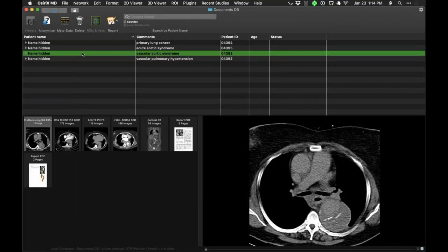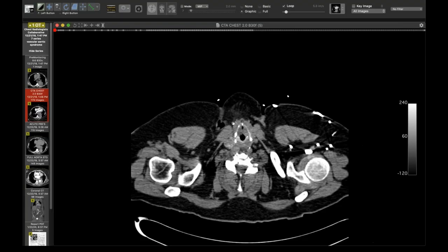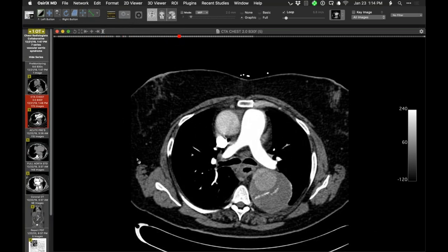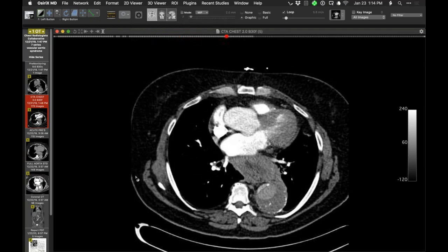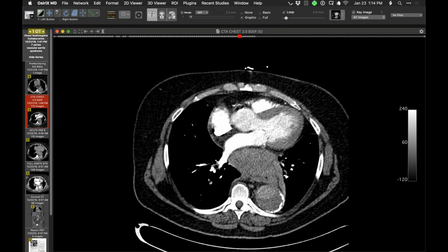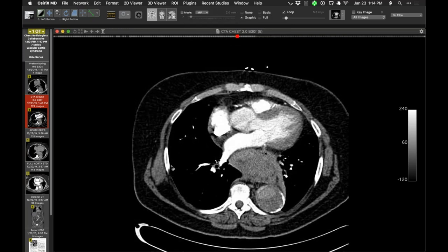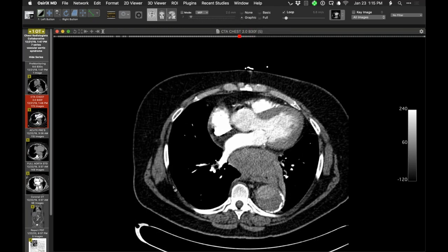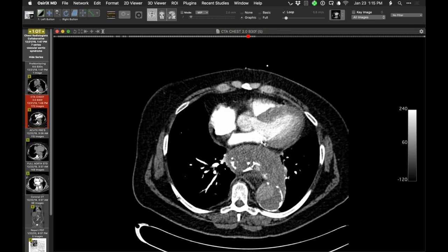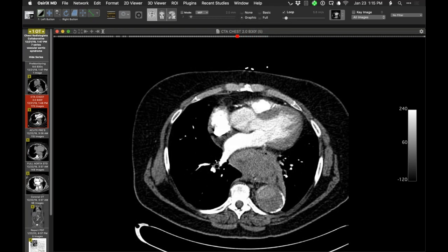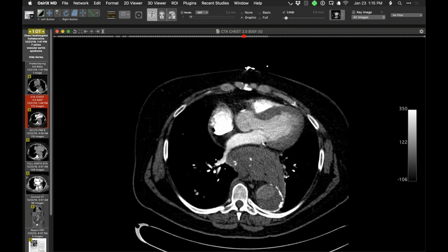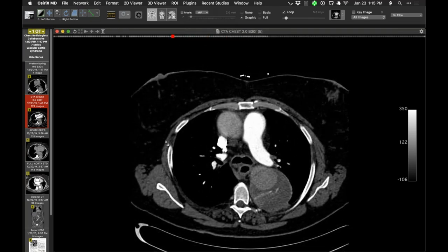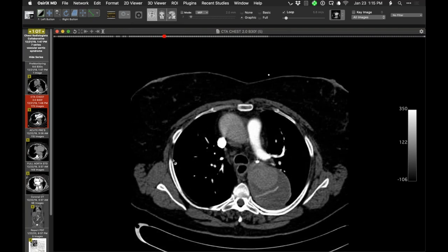Here is an interesting patient with a history of a type B aortic dissection a long time ago, and there are two really big interesting findings in the chest at the time of imaging. There is a very large dilated aorta, but the first thing that was really troubling were findings consistent with leak of blood into the mediastinum — separate from that aorta. They didn't consider her an operative candidate, so they elected to watch her. The other interesting thing is the pattern of calcifications in relation to the false lumen.